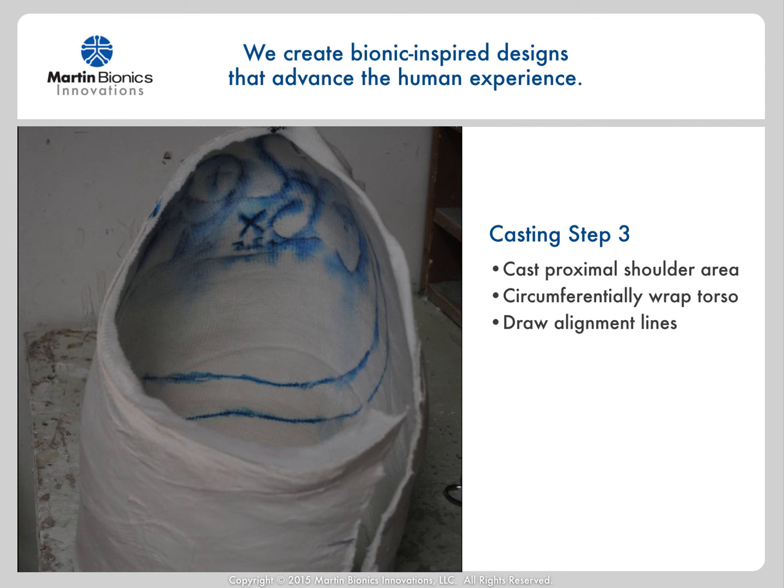We're now ready to pour the cast and prep for our modification.